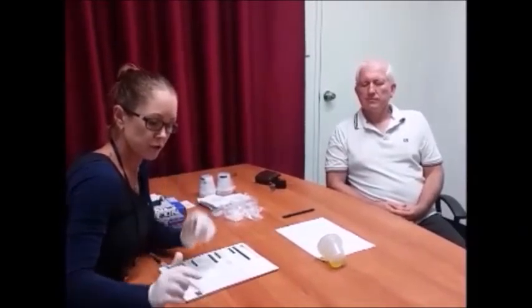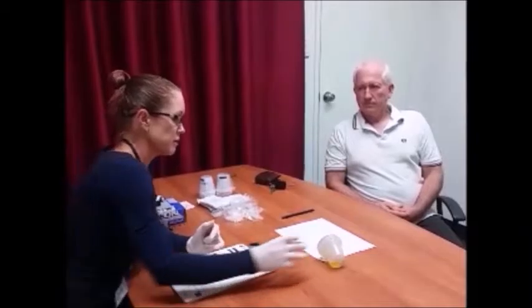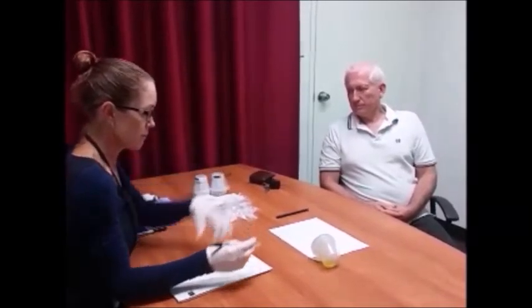I'm going to set my timer for 5 minutes so we can read the result at 5 minutes. The first thing I'm going to check on here is the creatinine, bottom left hand corner. I'll reference my colour card to ensure that the creatinine is a normal colour and document the value of it.